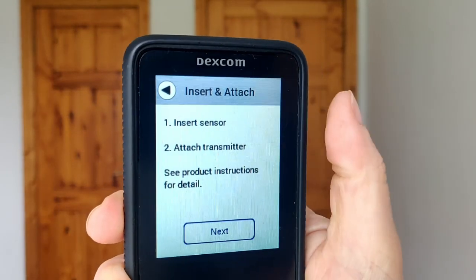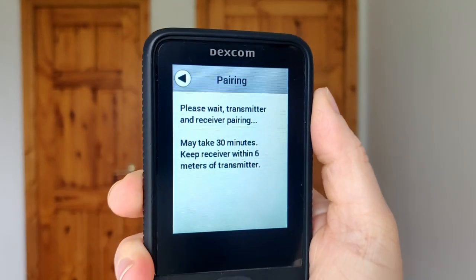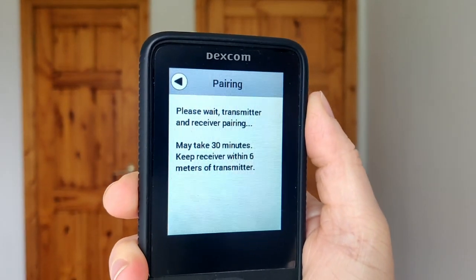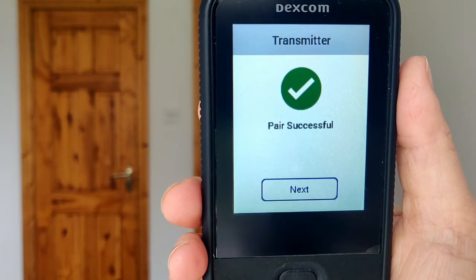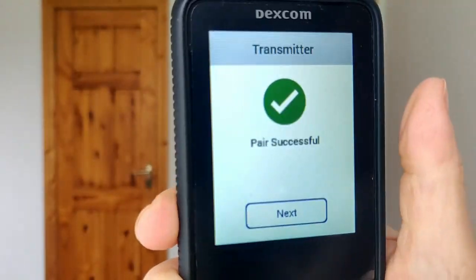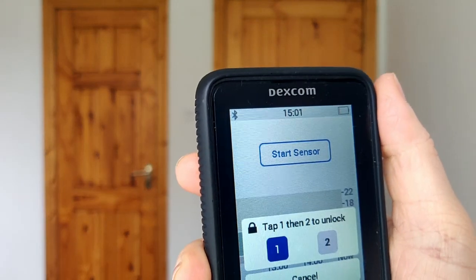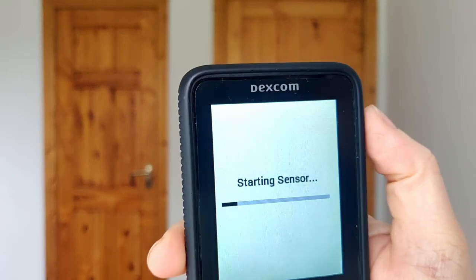All you need is your device — the receiver or the phone — to pair. Press next and it says 'Please wait, this may take up to 30 minutes.' You want to stay within six meters of the transmitter at all times. It actually paired almost immediately — within one minute. So our transmitter is on. Press next, then we start our new sensor.